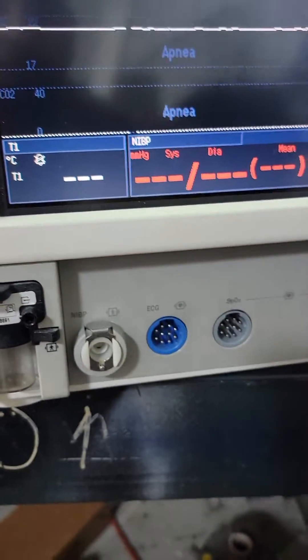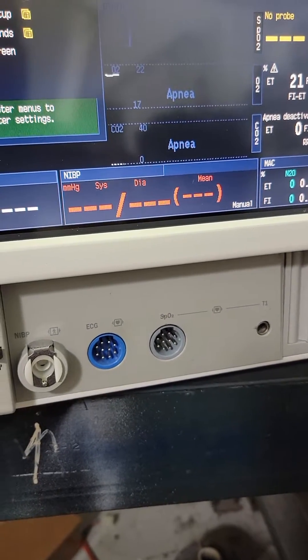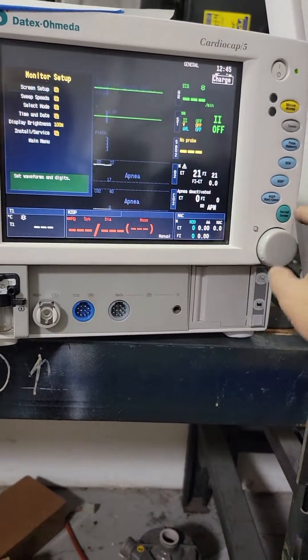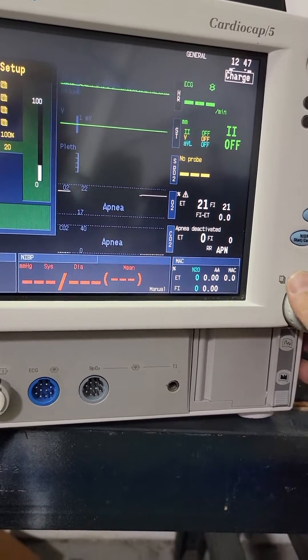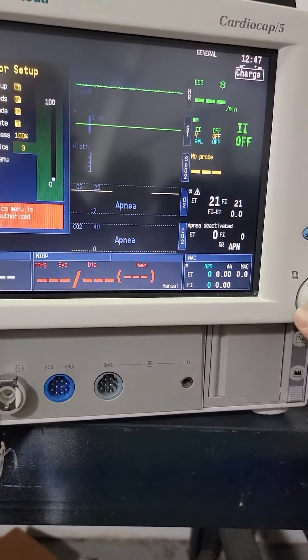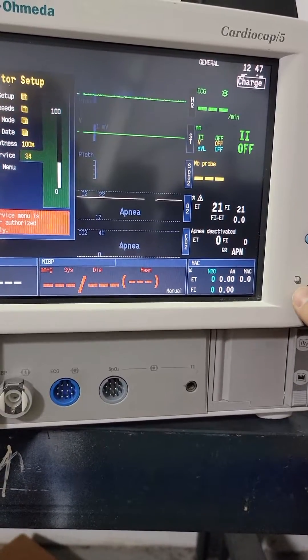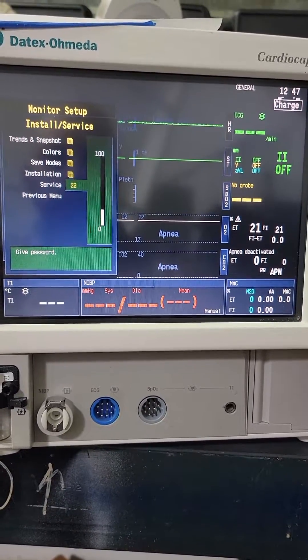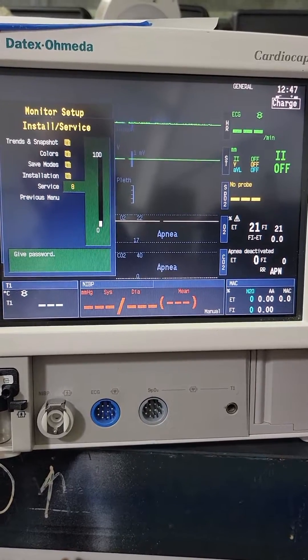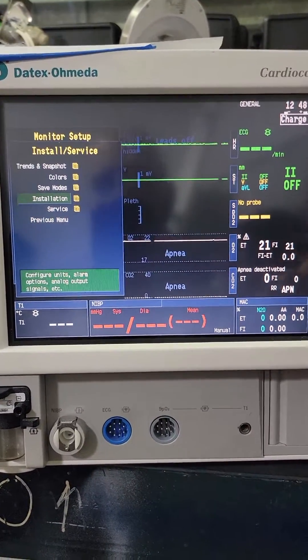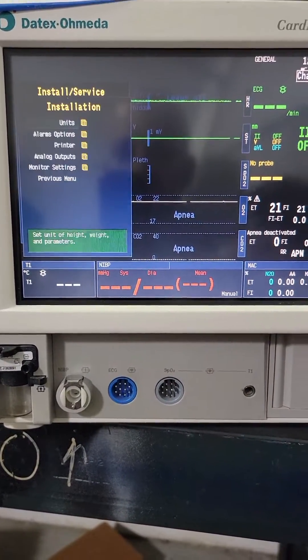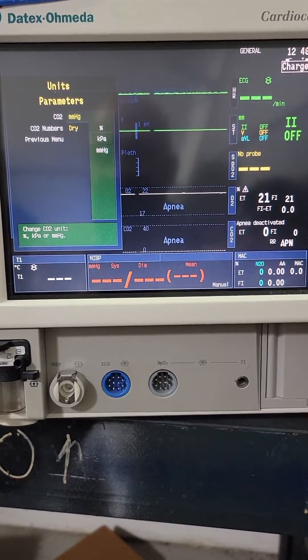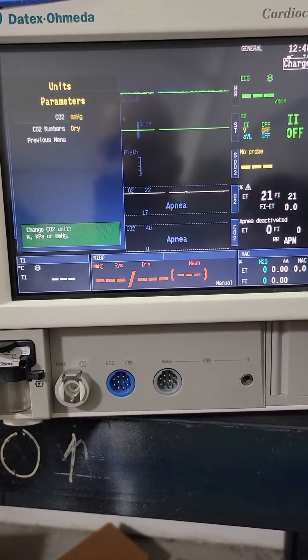So if you're seeing 40, that means your millimeters. To access this, go to the menu — monitor setup. Go to install, then service. I backed up a little bit; don't need to go into service. I'm just going to go to Installation, then Units Parameters. Boom — CO2. You can toggle between percentage, kPa, and millimeters — what we want on this one.